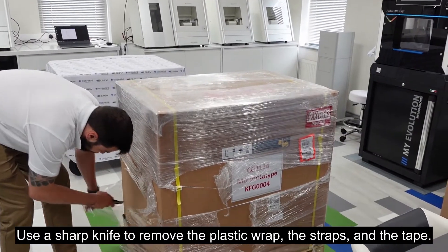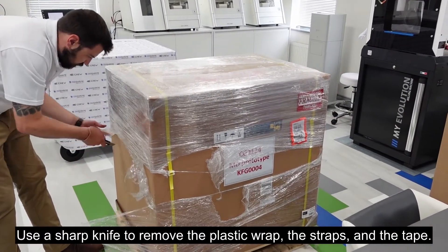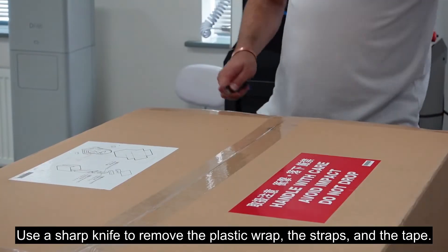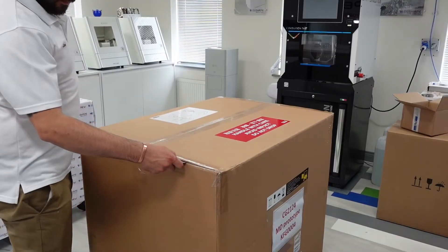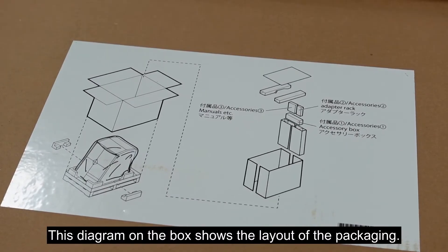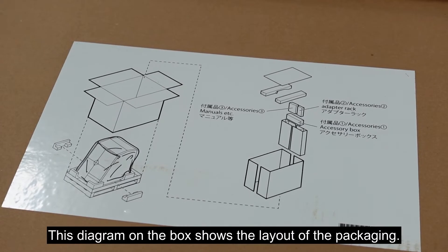Use a sharp knife to remove the plastic wrap, the straps and the tape. This diagram on the box shows the layout of the packaging.